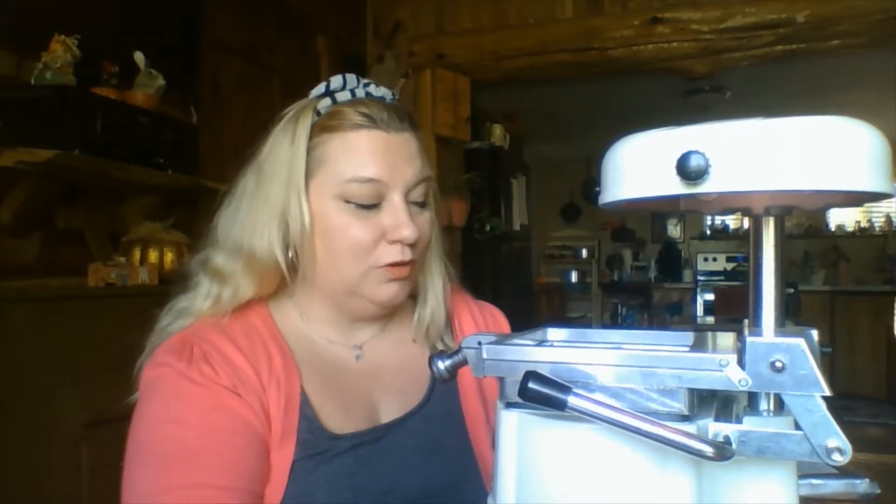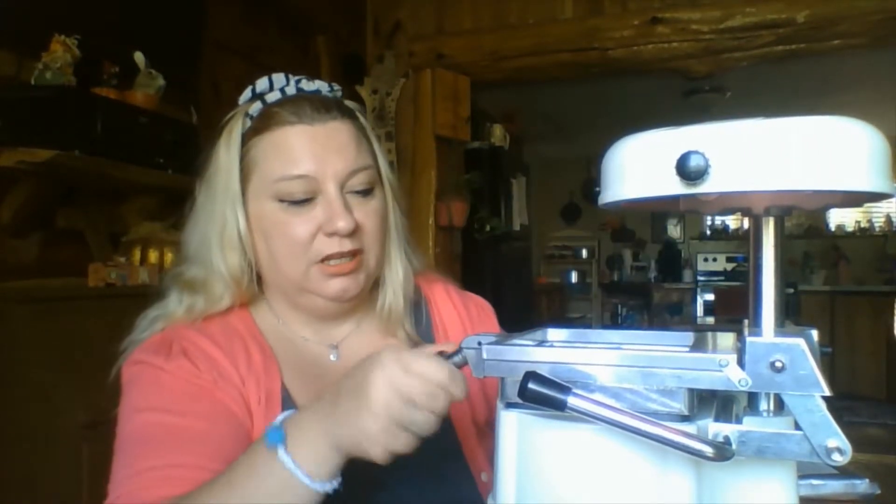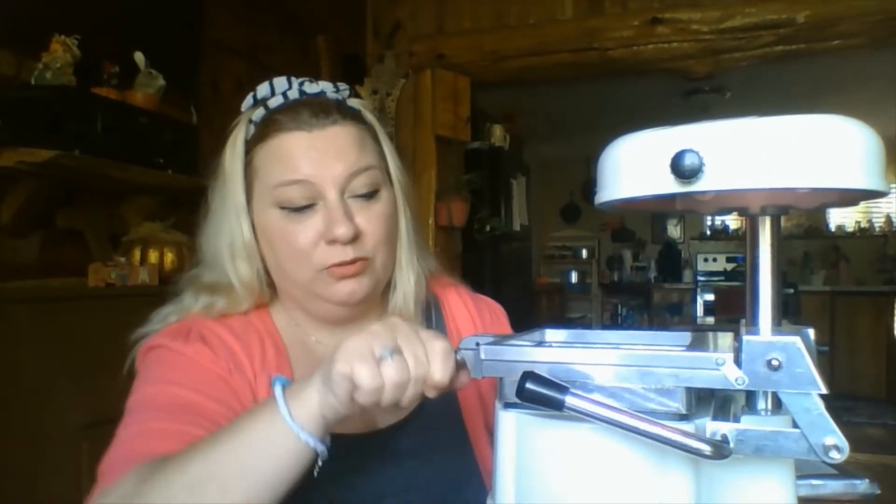Hi everybody, this is Dental Assistant Tutor and today I'm going to be going over how to make a custom bleaching tray or Essex. This is a vacuum form and it gets really noisy when you turn it on. So if you're working on patients in the office, I suggest shutting the lab door.